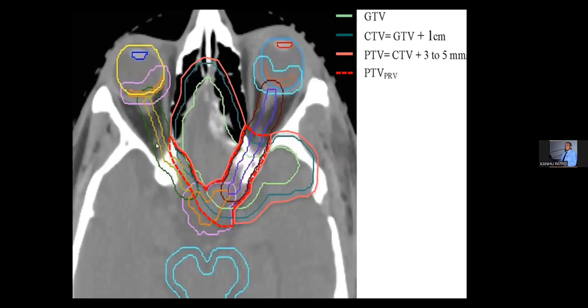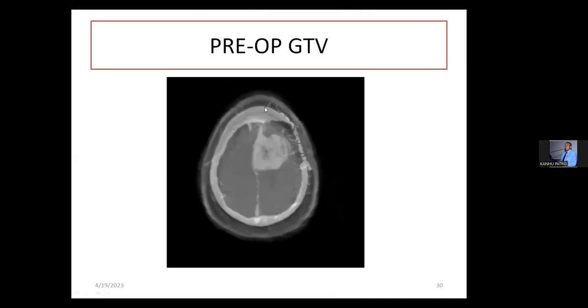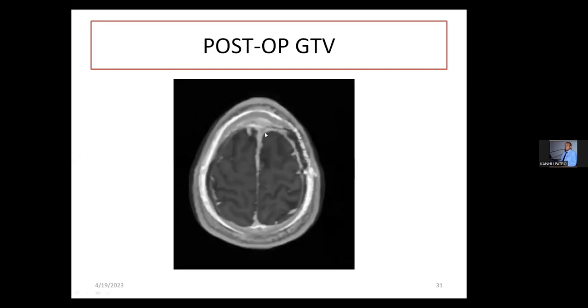These are very clumsy skull base lesions. So what should we do? Let's see one example here. This is a lesion of the left frontal region at the parafalcine region, where you can see this meningioma. After surgery, it looks like it was not a good surgery, but you can see the thickened dura here. Here, this is the thickened dura.